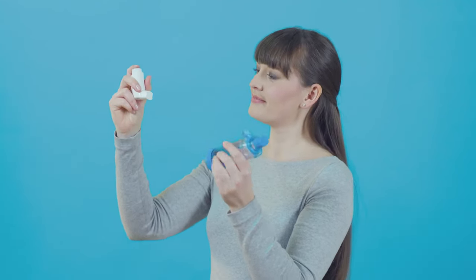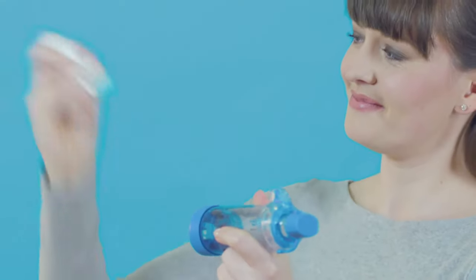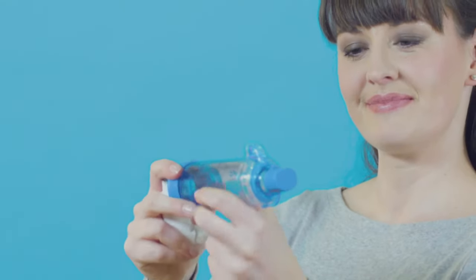To use your inhaler with a spacer using a single breath and hold technique, first hold your inhaler upright and take the cap off. Check there's nothing inside the mouthpiece. Shake it well. If your spacer has a valve, make sure the valve is facing upwards.